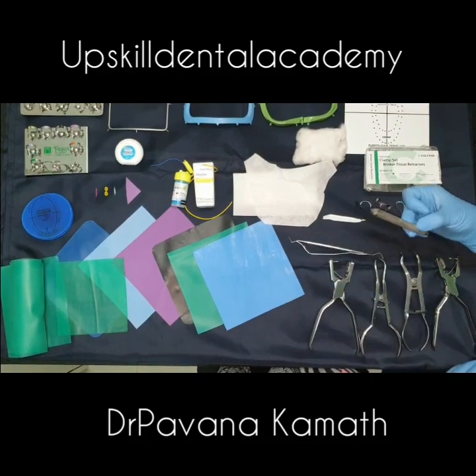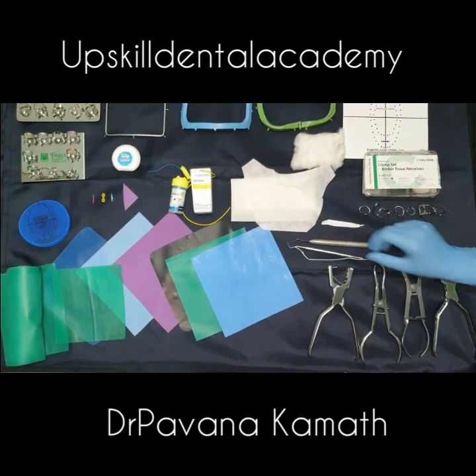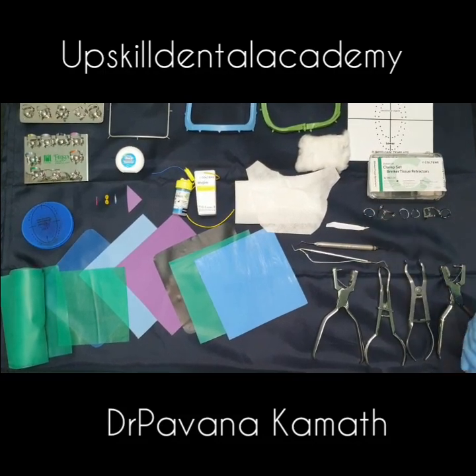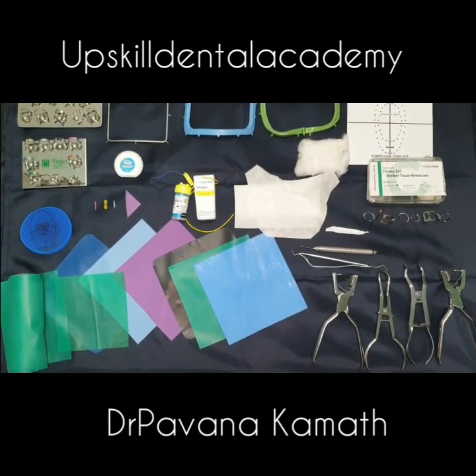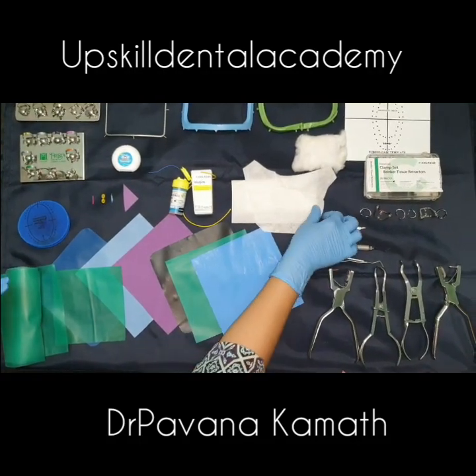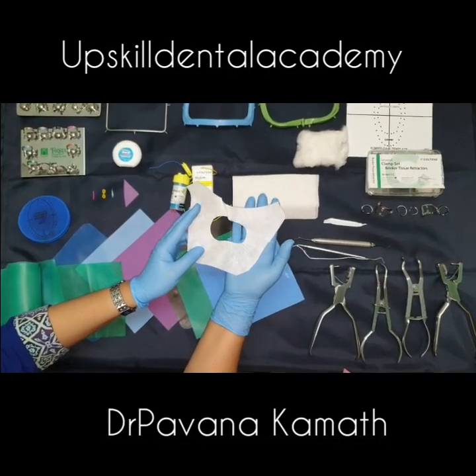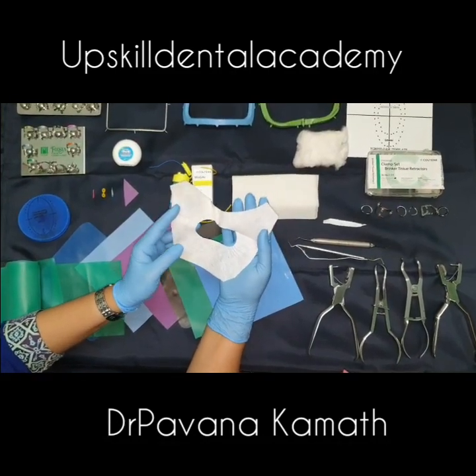The plastic filling instrument is used mainly to dislodge the rubber dam sheet off the wings of the clamp and to tuck it onto the tooth. The armamentarium also includes the rubber dam napkin — the benefit of the rubber dam napkin is that it acts as a barrier between the patient's skin and the rubber dam sheet.